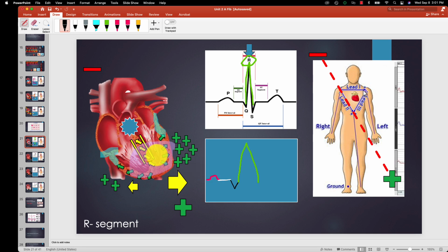And then boom, the left ventricle contracts. And we have this massive spike here. And we know that it's the left ventricle because it's the bigger muscle, right, than the right ventricle. It's so much smaller. It's going to have more positive activity here. We're going to have a massive spike in that ventricle activity here. And that's going to be indicated by the R wave.